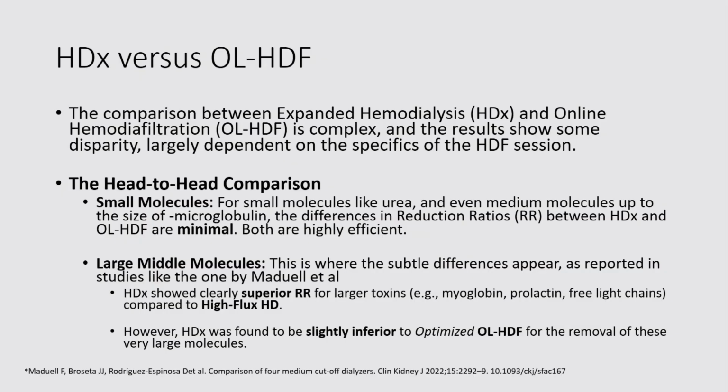But for large molecules, in one particular study done by Maduel et al., it was found that expanded hemodialysis was superior to high flux hemodialysis for larger toxins, but expanded hemodialysis was slightly inferior to optimum online hemodiafiltration with respect to large middle molecules.